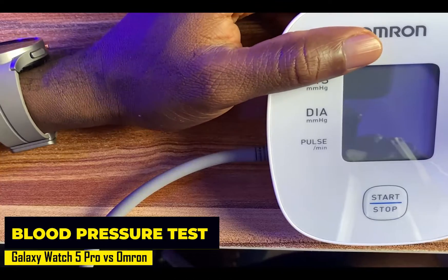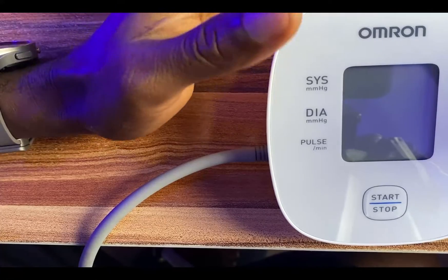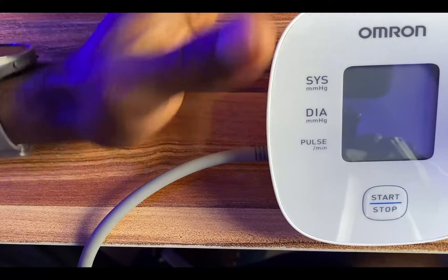If you own the Galaxy Watch 4, 5, or even the newly released Galaxy Watch 6 series, you should have blood pressure and ECG features on the watch.